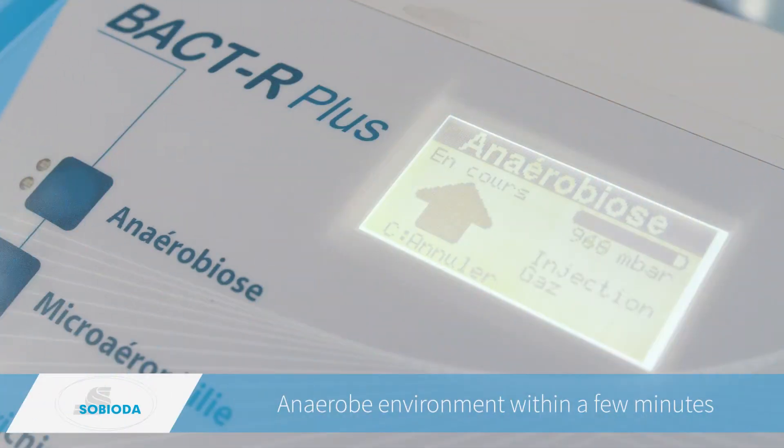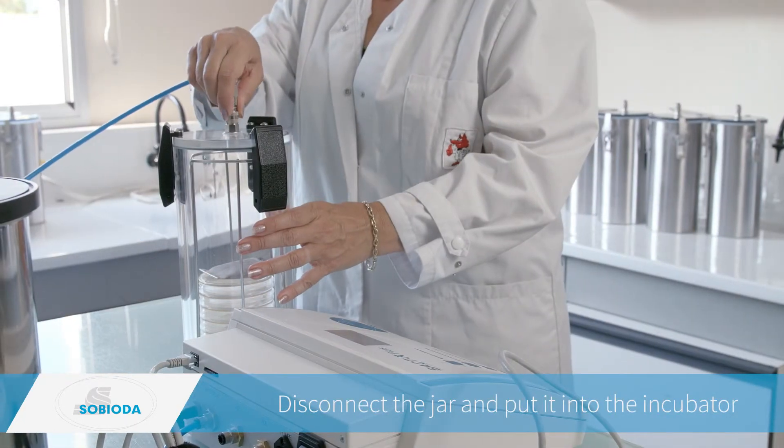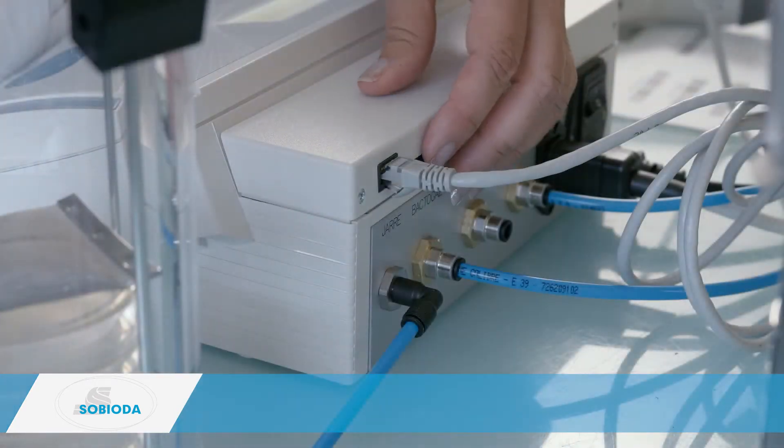After some aspiration and injection cycles, the anaerobe environment is reached. Step three: once the program is over, the jar can be disconnected and then put into the incubator.